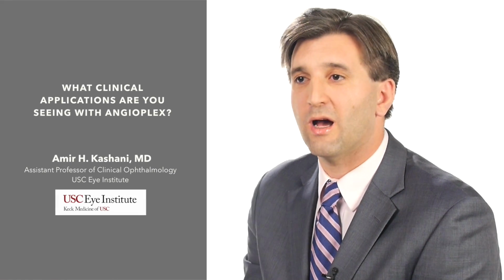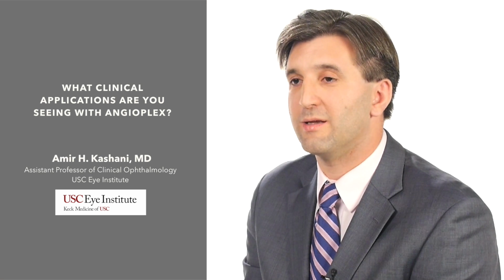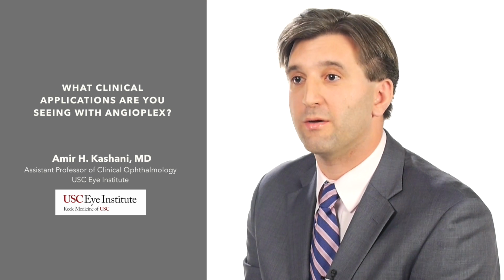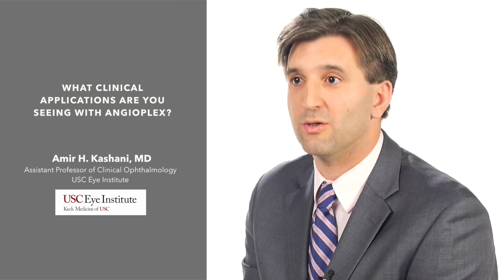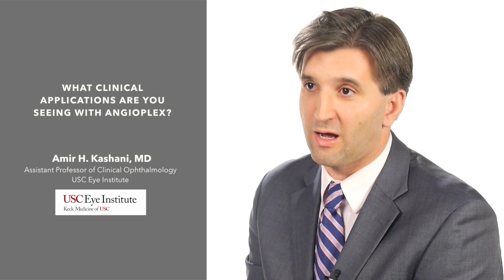So I think that there's a lot of potential applications, and one really obvious one is, for example, diabetic retinopathy. Diabetic retinopathy is characterized by changes in the vasculature that cause what we call capillary dropout or impaired capillary perfusion. And that's exactly what OCT angiography or AngioPlex is going to allow us to look at now, because we can see exactly where there is blood flow and where there is not blood flow.